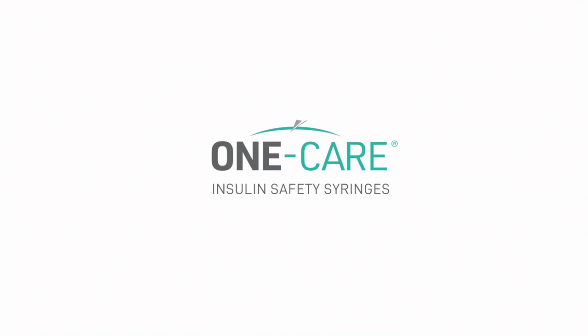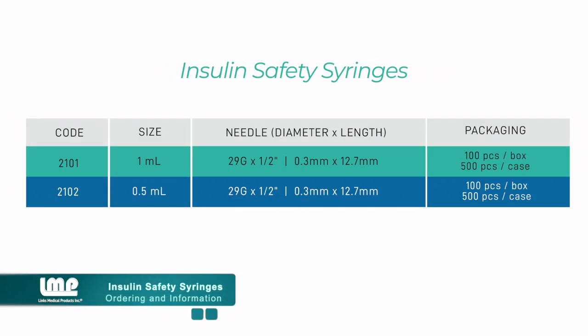One Care Insulin Safety Syringes are available in 29 gauge by 1/2 inch in both 0.5 and 1 ml sizes.